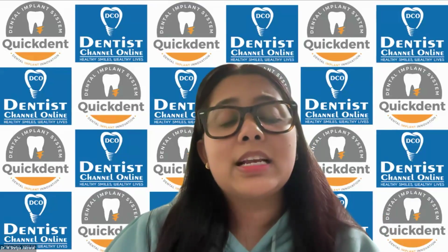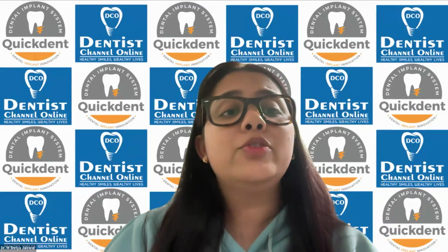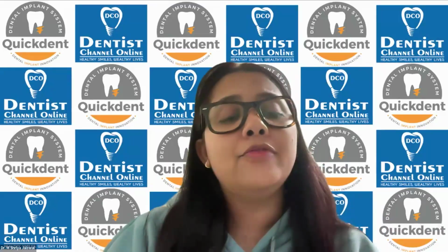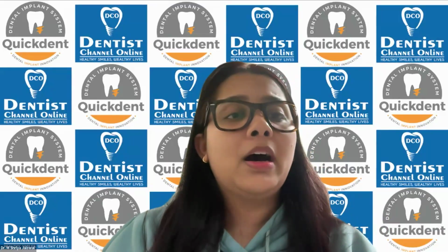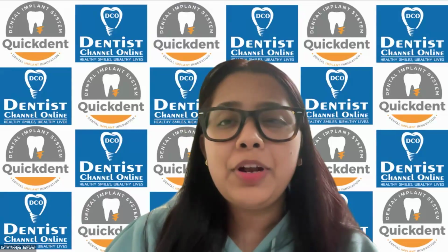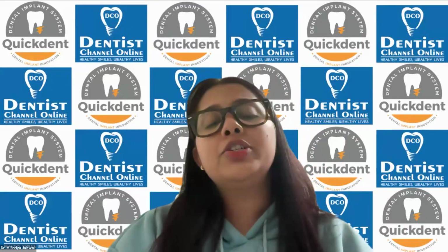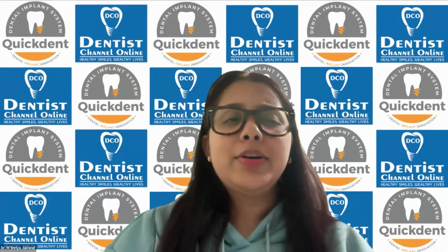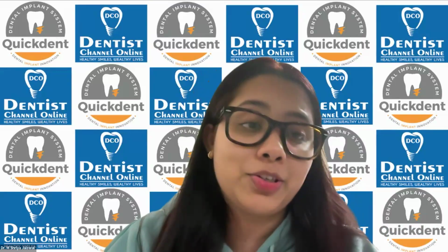Flap design around dental implants must be carefully planned to minimize trauma, reduce post-operative complications, and facilitate aesthetic and functional outcomes. Various factors, including incision type, flap thickness and tension-free closure, must be considered to enhance the soft tissue integration and long-term implant stability. So get ready to decode the secrets of the fundamental principles of flap design in implant dentistry.